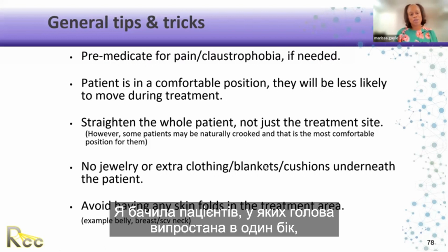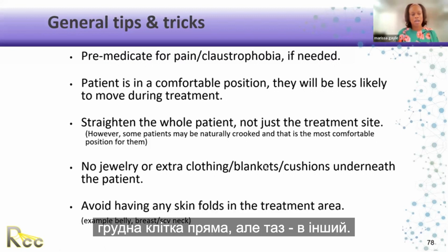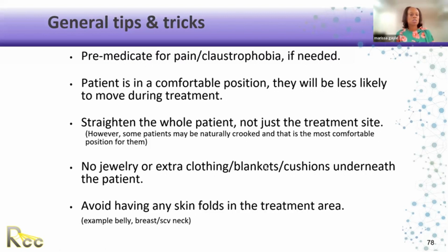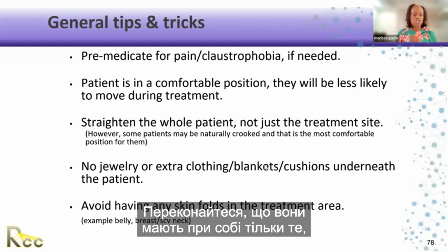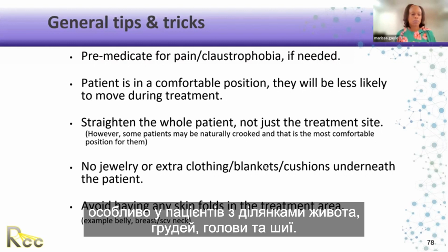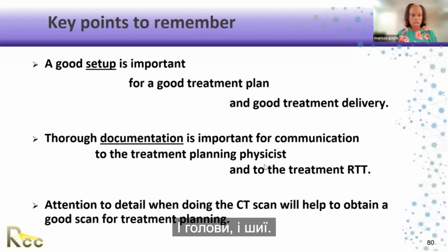I've seen patients where the head is one way, the thorax is straight, but then their pelvis is another way. No, make sure the entire body is straight. No jewelry, no extra clothing, blankets, or cushions. Make sure that they just have on them what they were simmed in. And watch out for skin folds in the treatment area, especially for belly, breast, and head and neck patients.